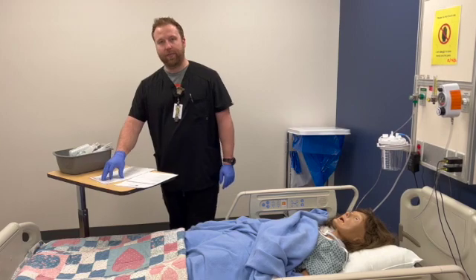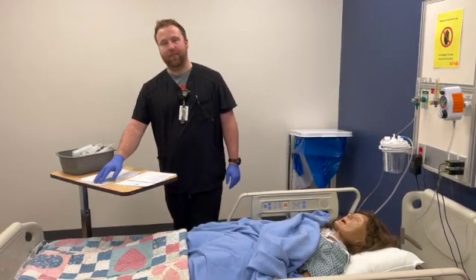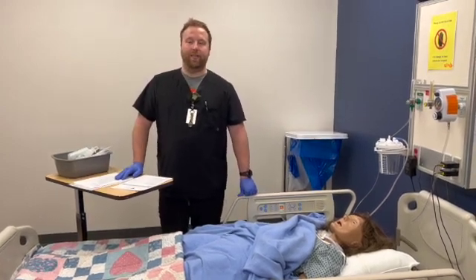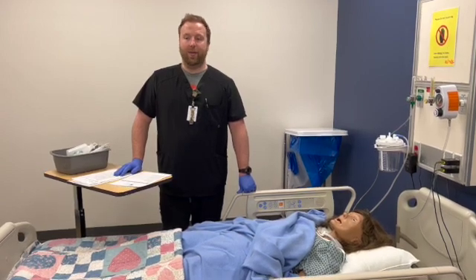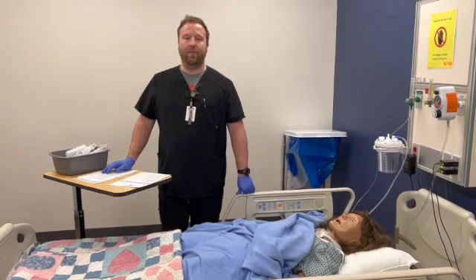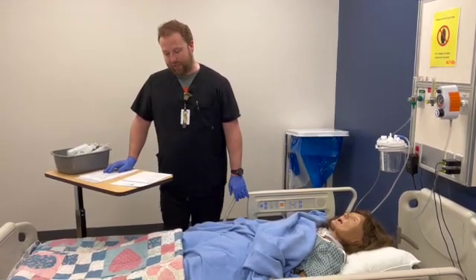We want to go over a few different reasons why an NG tube might be placed. When a patient is on a ventilator, they'll get an NG tube. Whenever a patient has a bowel obstruction is another reason they'll do an NG tube. Or for patients that maybe need some nutrition, they'll go from an NG tube and transition to a PEG tube.